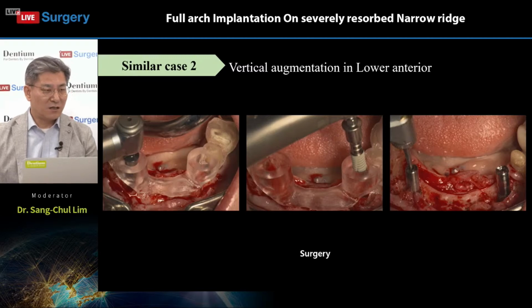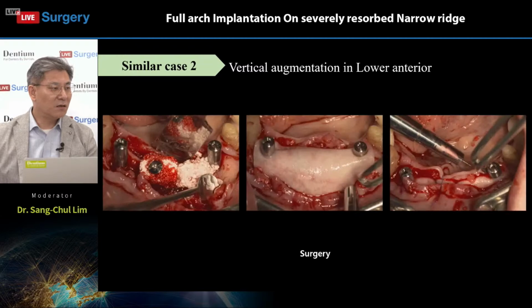So with the implantation in a better and proper position, getting higher insertion torque, we can connect the healing abutment, the scan abutment, and apply the bone graft material, then apply a membrane after this, and suture. These procedures are called transmucosal GBR.